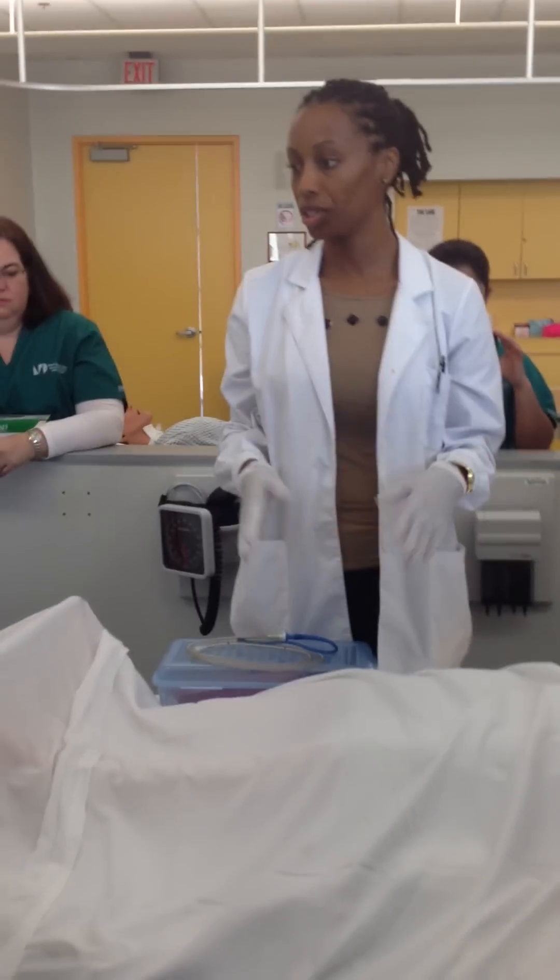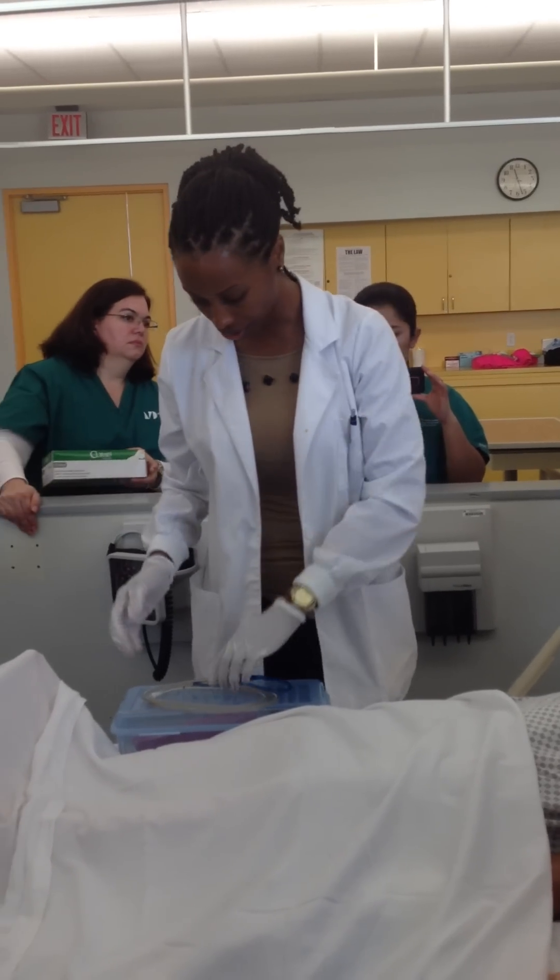So you've already talked to the patient, you've got an assessment, you've verified your order, you've checked the name band and everything. So now you're going to start.